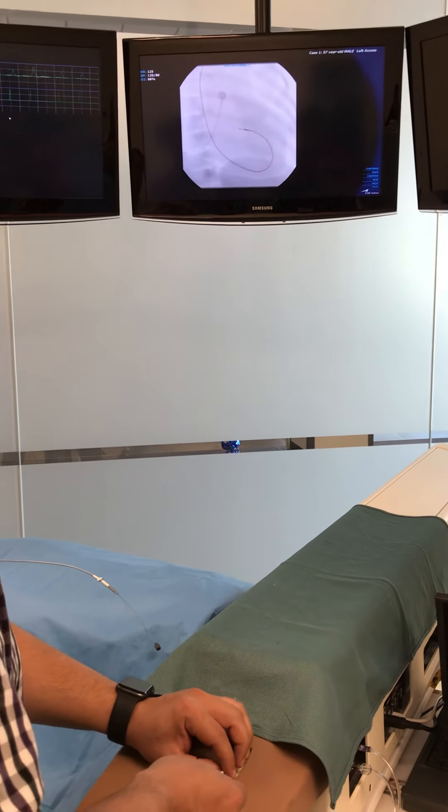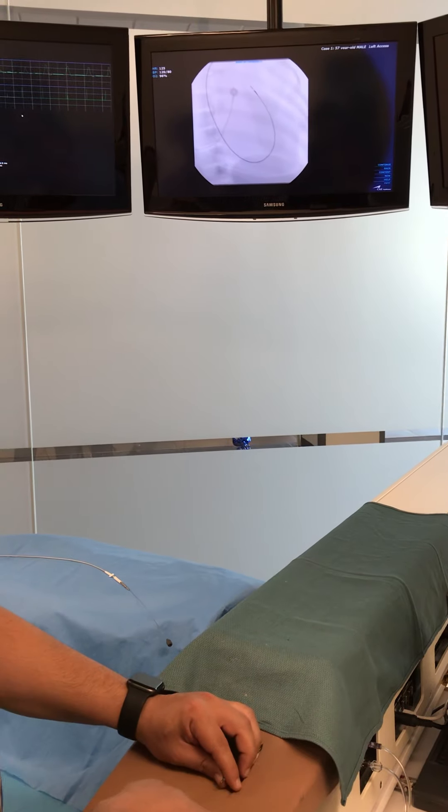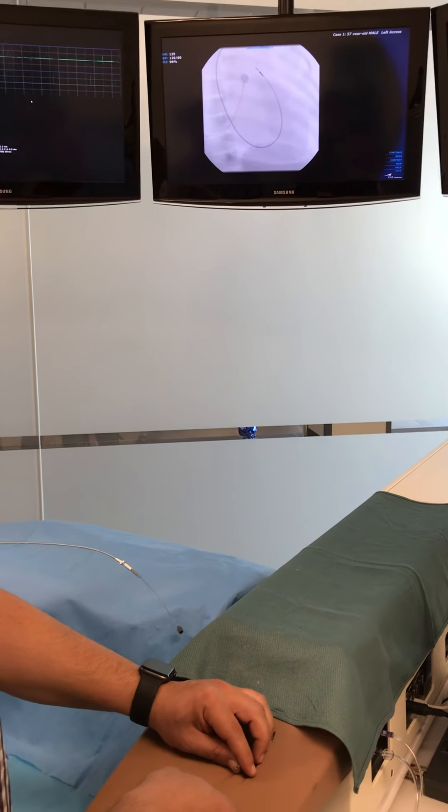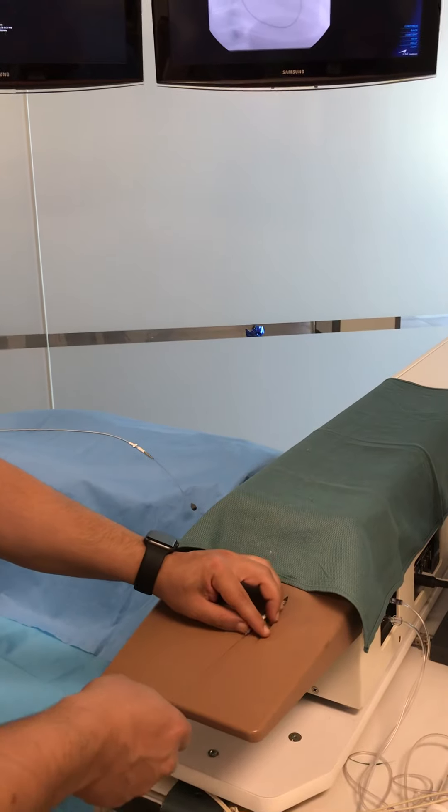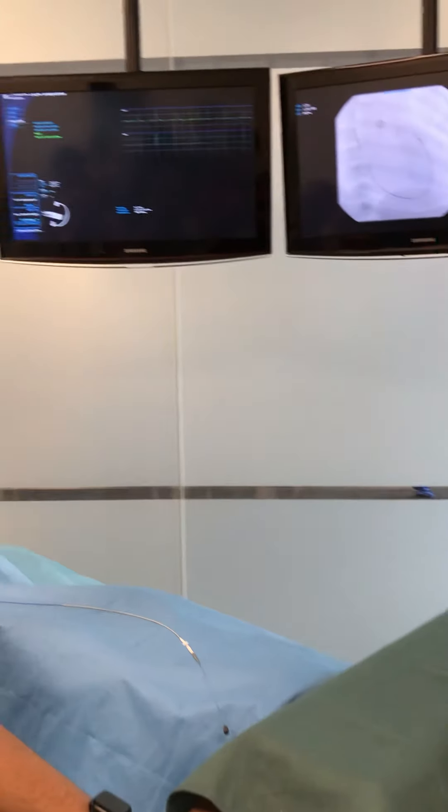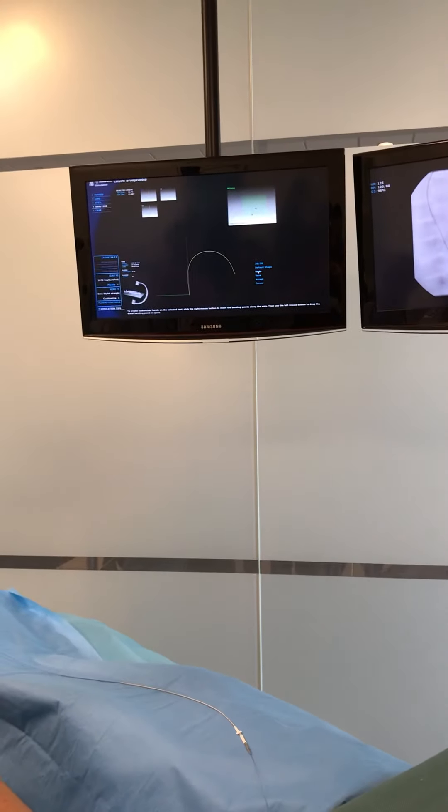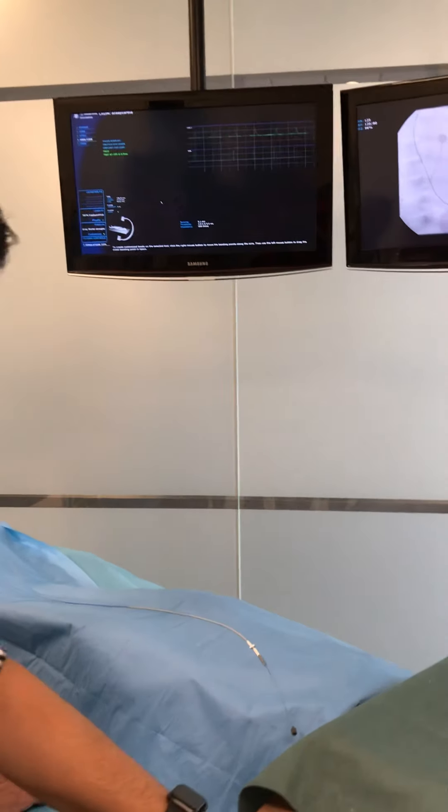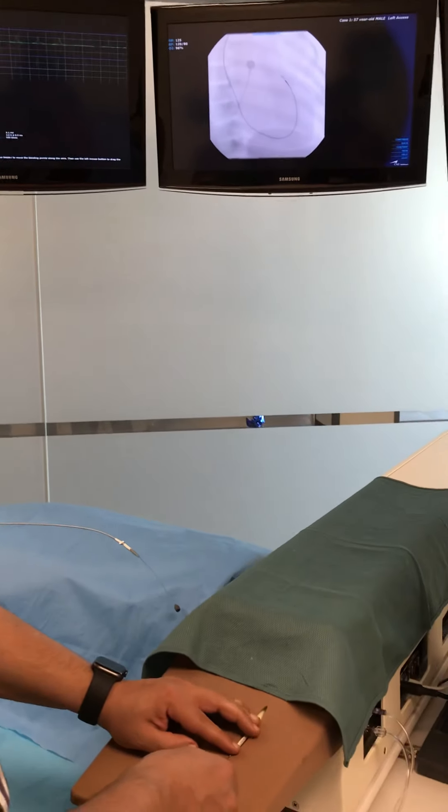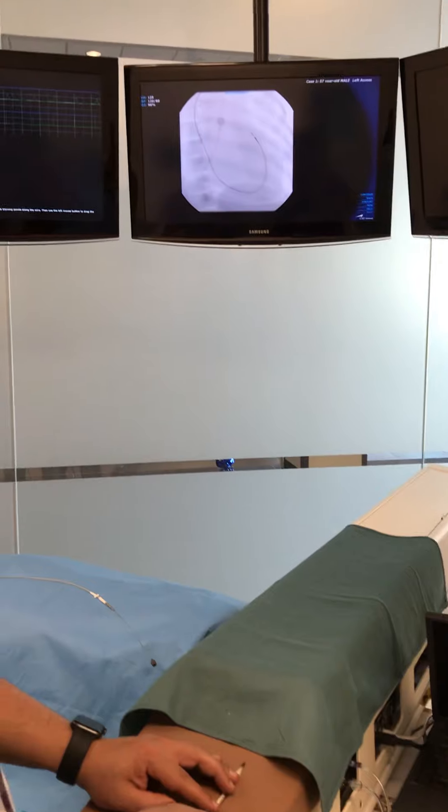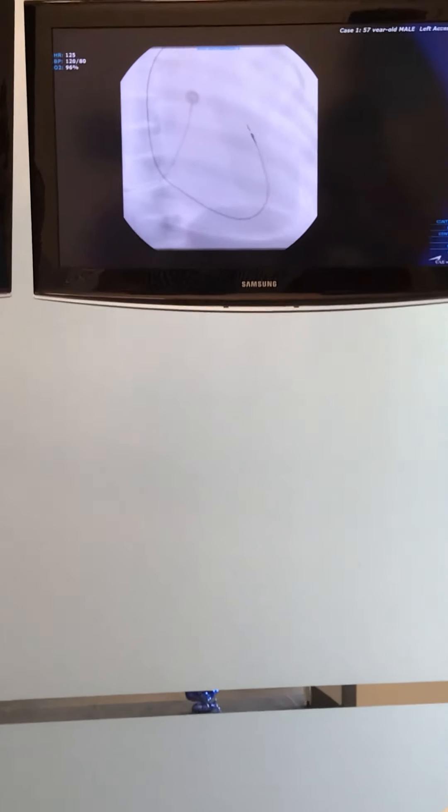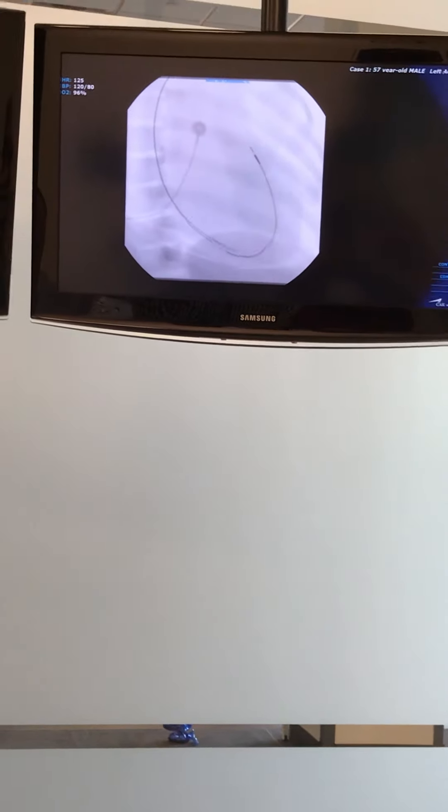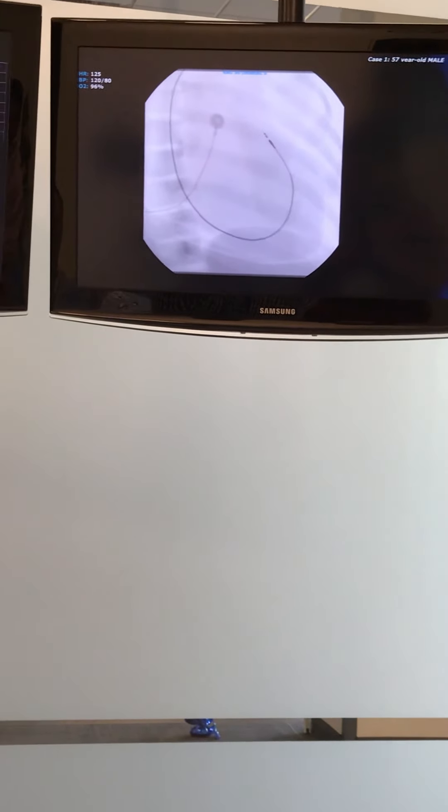Just draw your stylet back up, like you're going to swap it back to the mechanical stop. And now I say, be straight again. That's all the way out to the tip. It thinks it's a straight stylet. So you're swapping out now for the straight. Advance it out so it moves up above, because it just goes to the tip, and that's it.